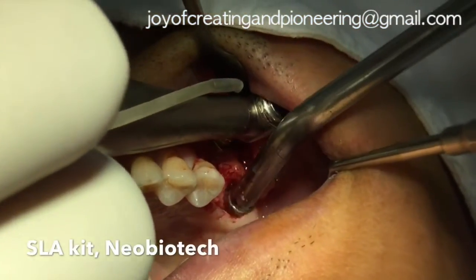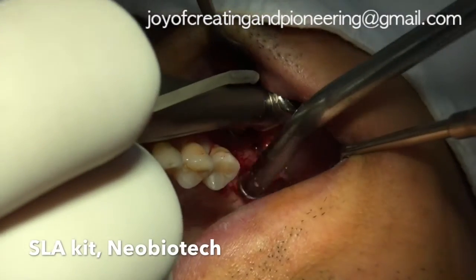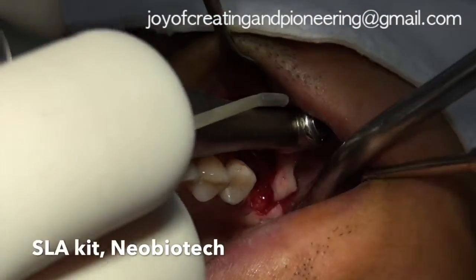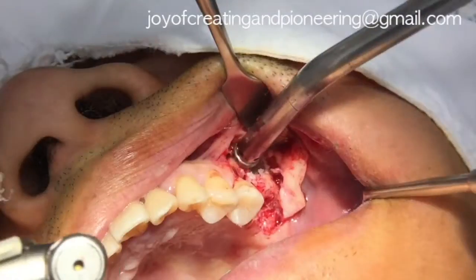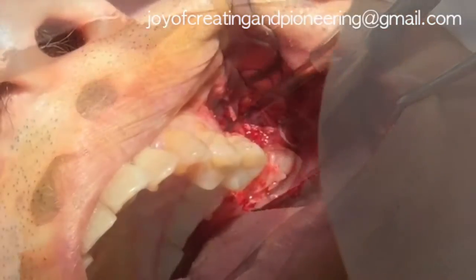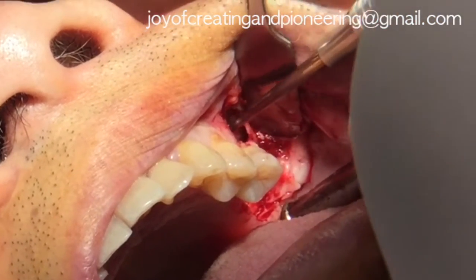SLA reamer from the SLA kit by Neobiotech of Korea was used for the osteotomy. Within a minute, the lateral wall was created without any perforation of the membrane. Using curved elevators from the kit, the Schneiderian membrane was carefully elevated from the sinus floor.